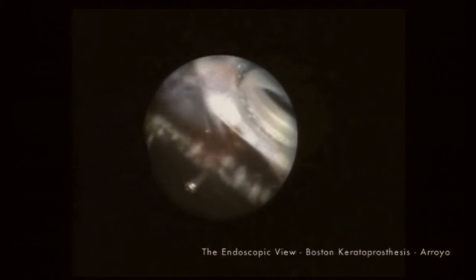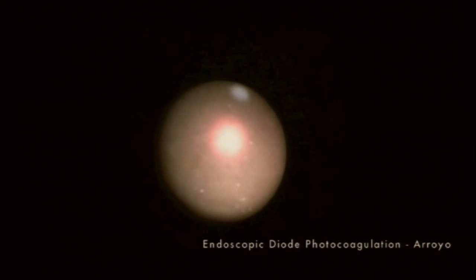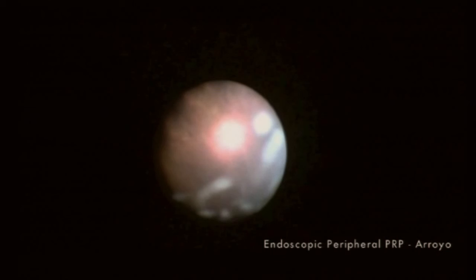Finally, you have the endoscopic view of the Boston keratoprosthesis. Another group of patients that are benefited by endoscopy are patients with neovascular glaucoma. In these patients, panretinophotocoagulation treatment can be very effectively placed in areas of ischemic retina. The endoscope is particularly valuable in treating the far periphery of the retina between the equator and the ora serrata.